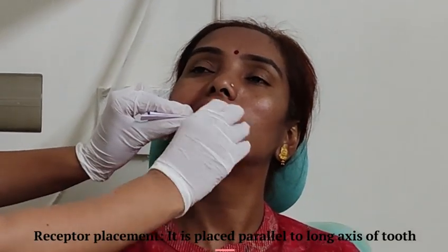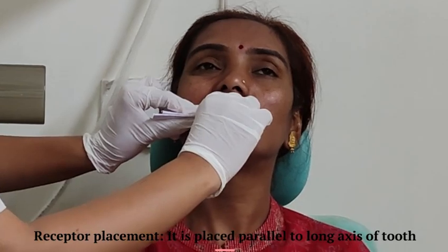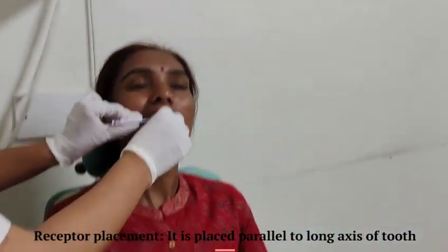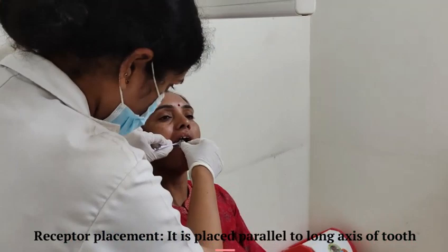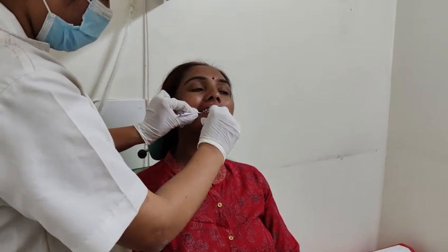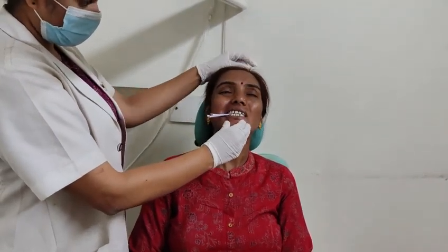The receptor is placed parallel to the long axis of the tooth. The patient is asked to bite on the receptor holder. Hold the receptor in place until the patient's mouth is completely closed; this will prevent displacement of the film.